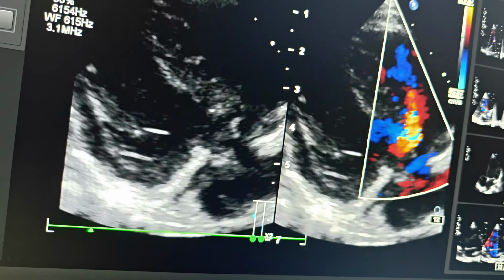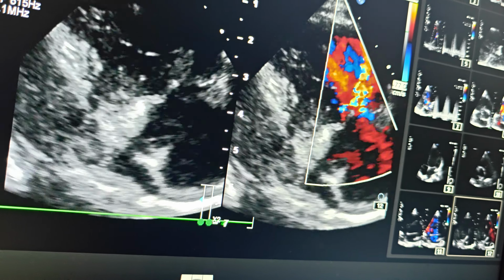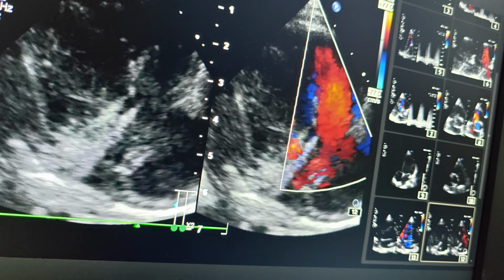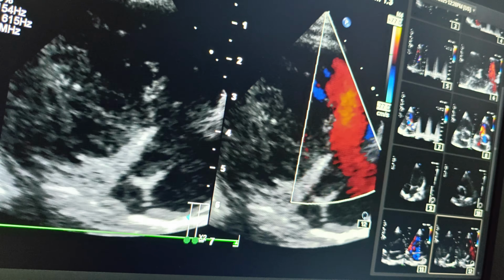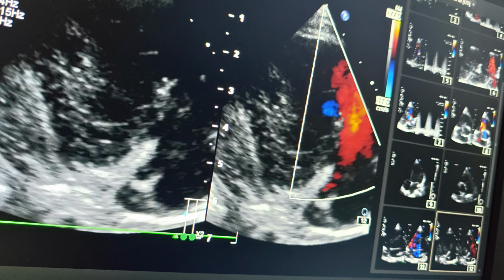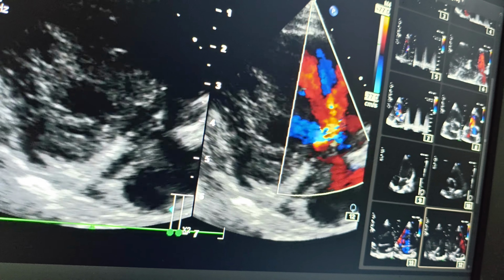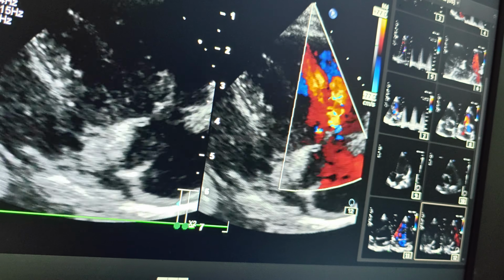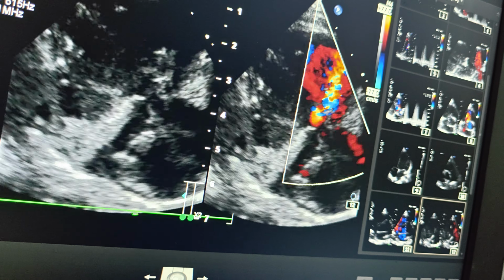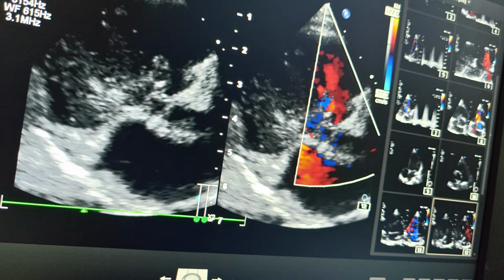Again, you can see this is the parasternal view, right ventricle inlet view. So whenever you make the right ventricle inlet view, the VSD will become more prominent, better seen. If you are making the right ventricle inlet view, towards the tricuspid valve, and your image is showing the tricuspid valve, then VSD becomes more visible, clearly visible. That means it is perimembranous VSD. If it just simply disappears, it means this is not perimembranous VSD. That is the point from this clip.